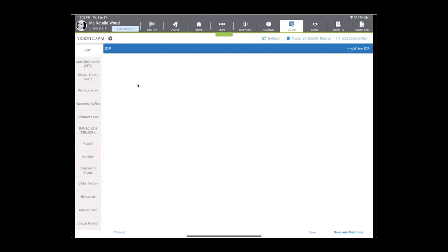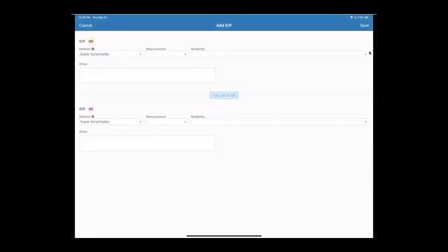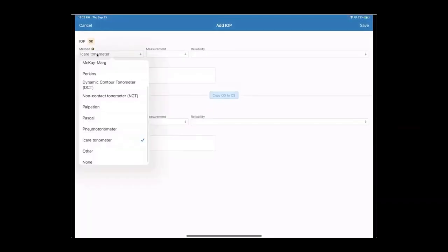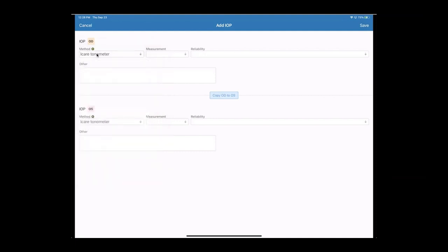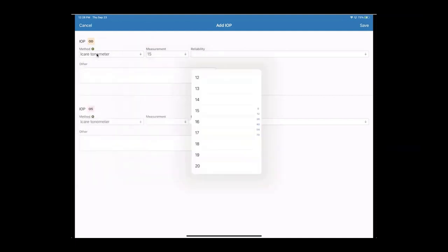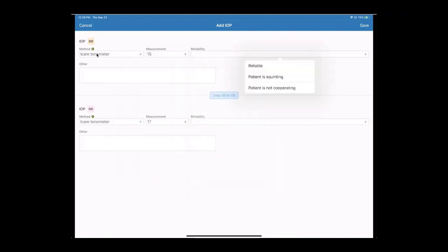So you're not going to utilize these sections for everyone, but I will say that the pressures, visual acuity, pupils, motility, and visual fields are the quote-unquote required fields to help you maximize your insurance reimbursement. So for today, if we were to add a new pressure reading, we can click on add new IOP. It's going to remember the way we like to obtain that measurement, and then with the drop downs, we can just make our selection for the test today and even notate the reliability.